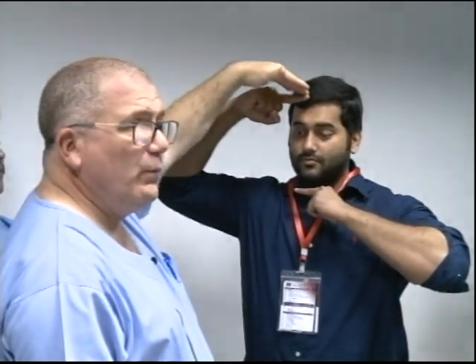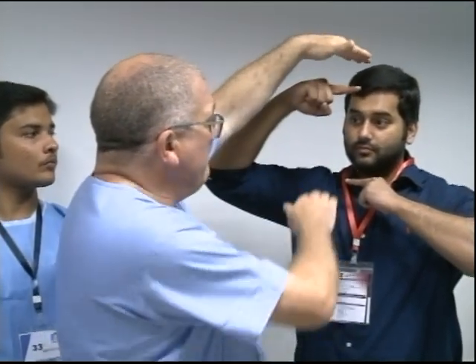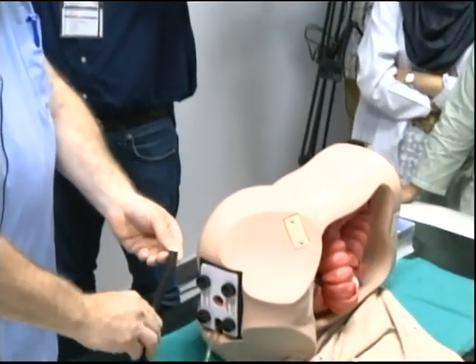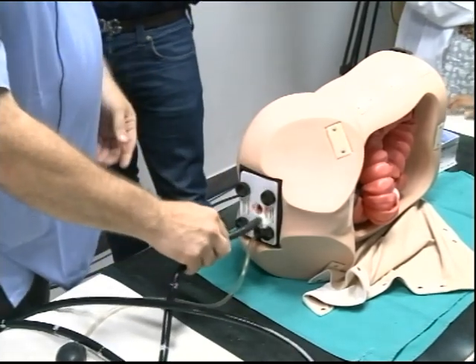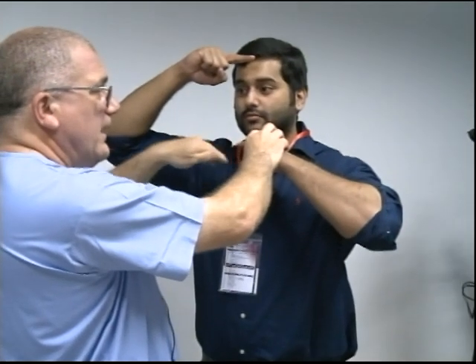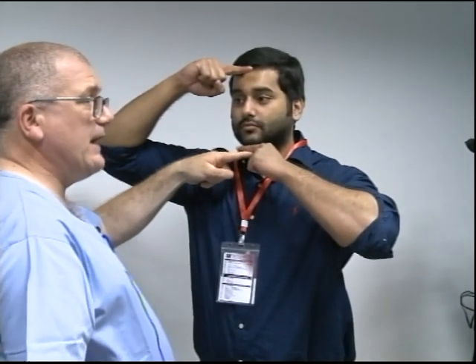If you look, the top of the scope is going to catch that. The actual lens is in proportion, his eyes are in proportion, but the lens is offset, the camera is offset. So what it picks up is an offset image. Because his chin would be lower, he would actually catch it. So when you're going forward with the scope, just because that fold is out of view doesn't mean your scope won't catch it. So you have to duck your head to lift up. You see where I'm coming from?